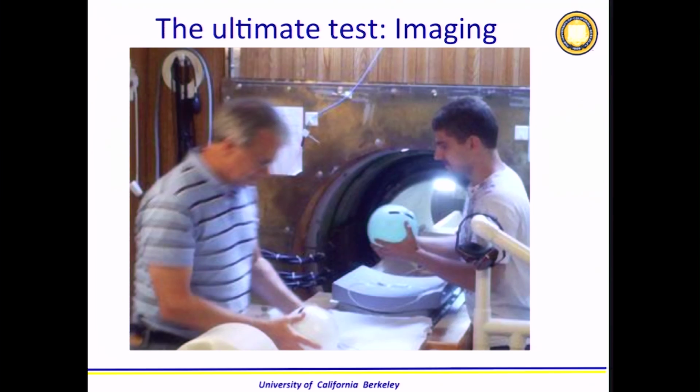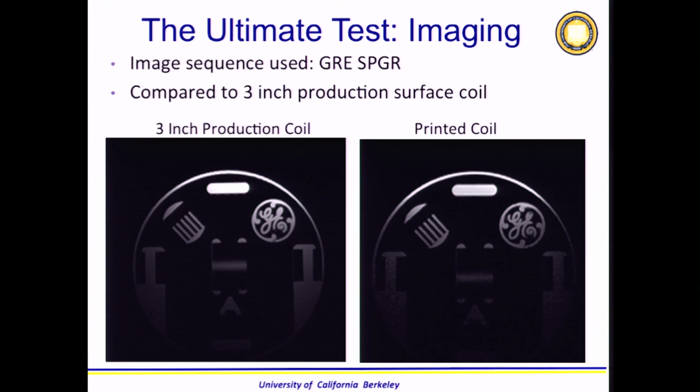And we do that either at Stanford or at UCSF with our collaborators. This is done at Stanford. It is our collaborator, and this is my student. Here's the phantom, which basically mimics the chemistry of our body. And you see that we place it round because we want to make sure that the coil is conformable. And we just place it there, and then we compare these coils to traditional coils.